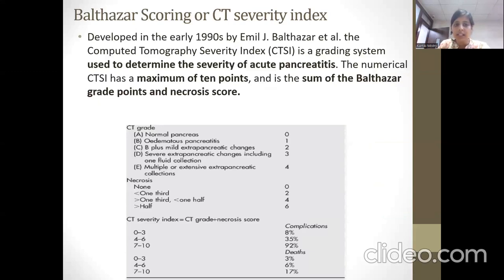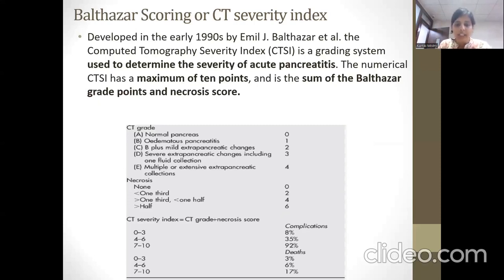CT grades: normal pancreas scores 0; edematous pancreatitis scores 1; edematous pancreatitis with mild extra-pancreatic changes scores 2; severe extra-pancreatic changes including one fluid collection scores 3; and multiple or extensive peripancreatic collections scores 4. For necrosis: none scores 0; less than one-third scores 2; one-third to less than one-half scores 4; and more than one-half scores 6.